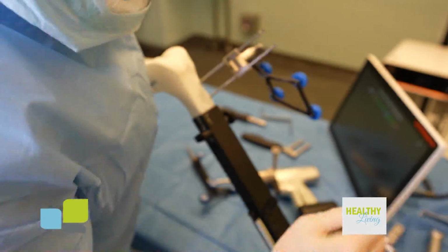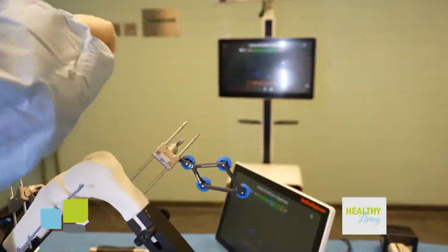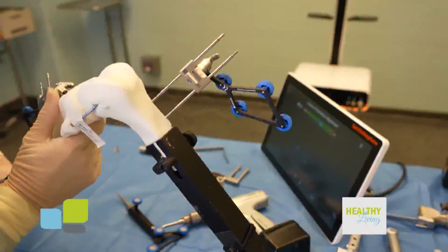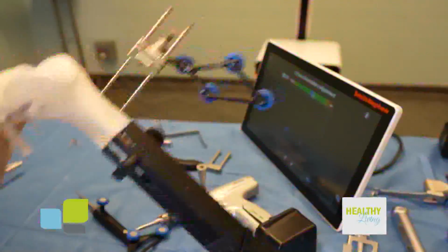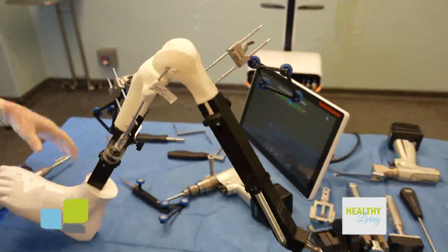Okay. So now we have everything assembled. And if you look at our computer, our Corey robot, you can see the blue square and the gray triangle. Actually, as I manipulate the leg, you can see how those things move. So that robot is now recognizing where this leg is in space. Okay? So now I'm going to give it some key data points.